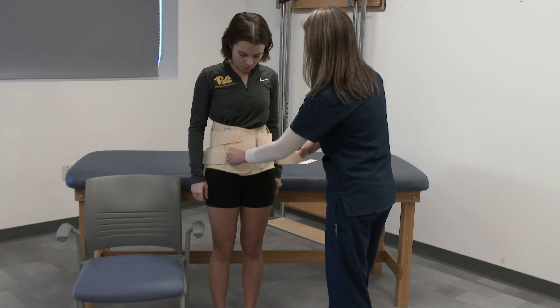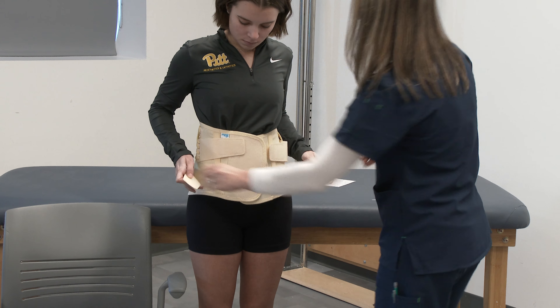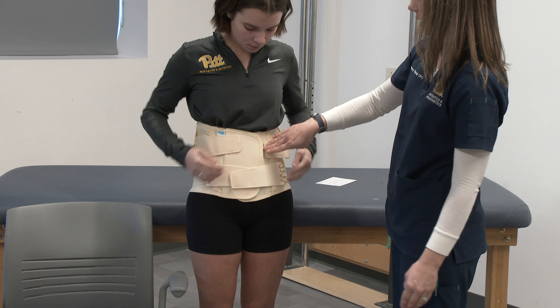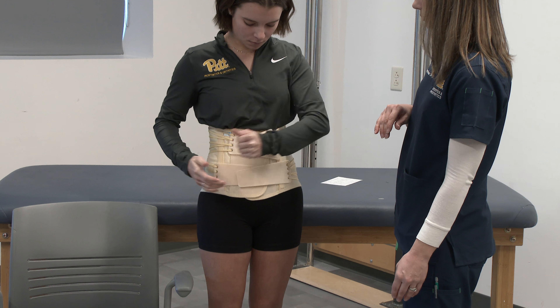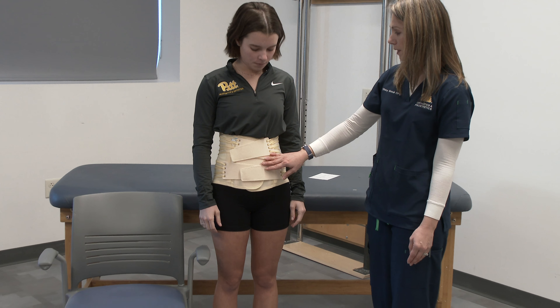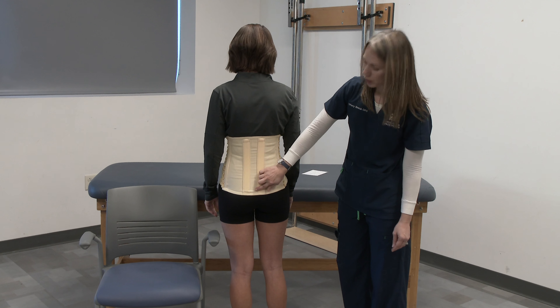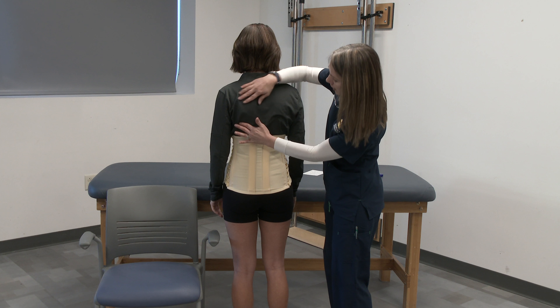You will want to put the stays on the posterior side. Wrap around left first, then right, and then always snug from inferior to superior. You can have the patient hold them and instruct them to pull out at a 45-degree angle and then place them on top of the velcro, and do the same with the top straps as well.